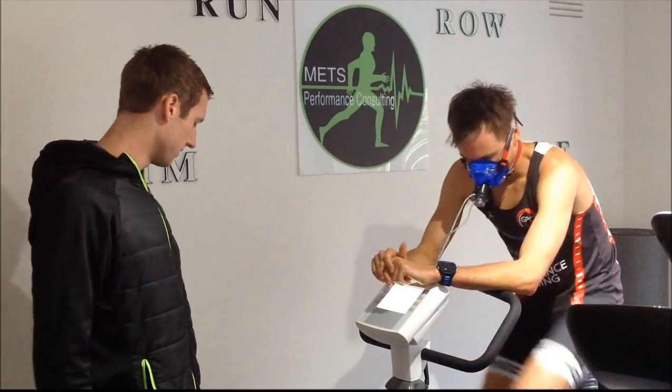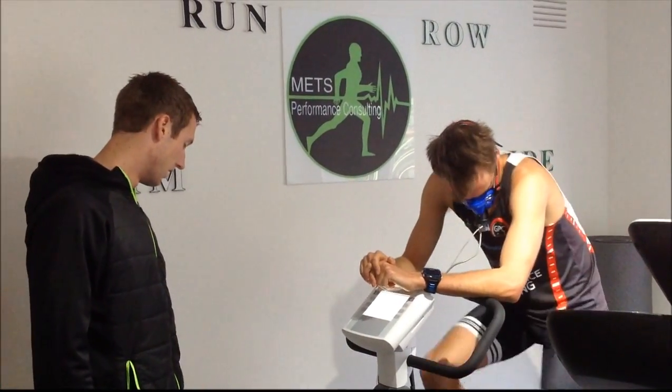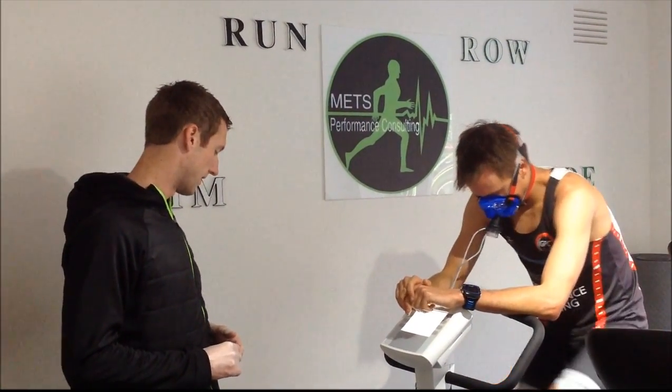We're about 10 minutes into the test now. Simon's just clocked up 210 watts, heart rate 143 — he's doing the VO2 pretty comfortably. We'll get the halfway point here, just concentrating on staying smooth and keeping his breathing steady. The pain will start probably in about 5 minutes.